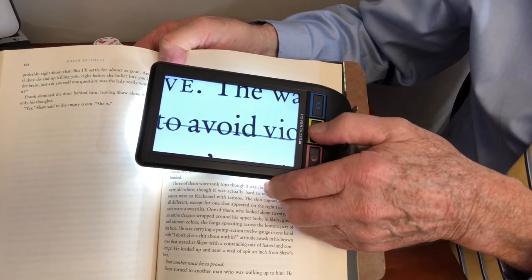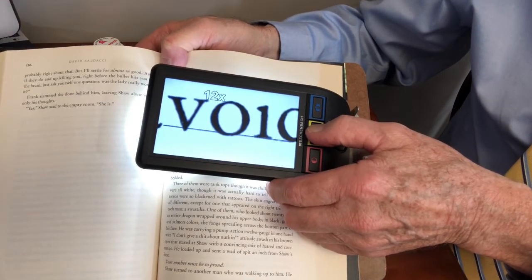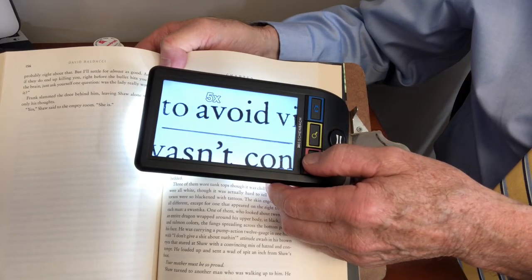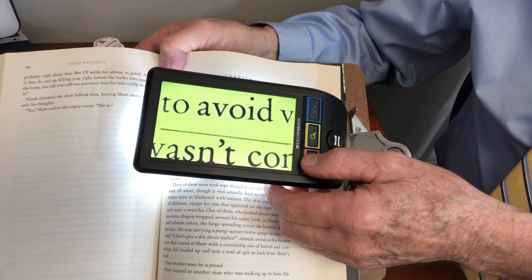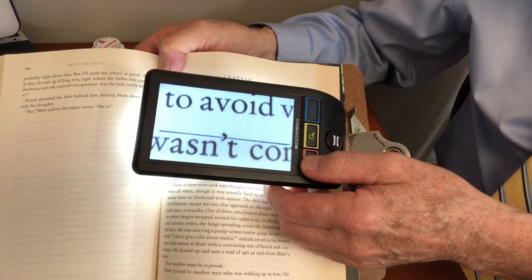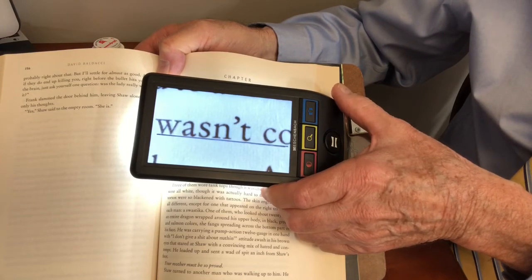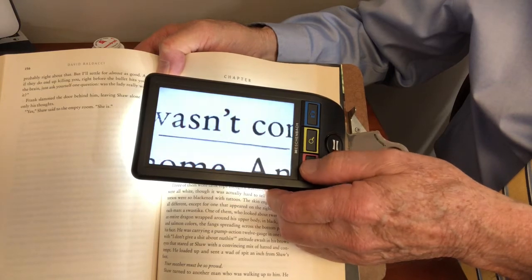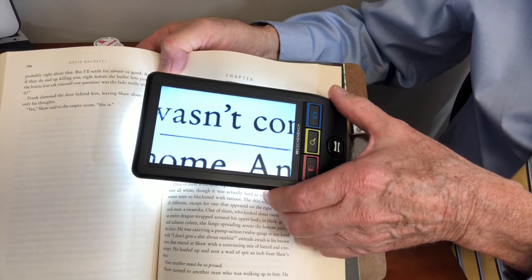You can change the magnification of it — there are four different magnification levels and there are also different color arrangements: high contrast black and white, white on black, black on yellow, yellow on black, and the final one is full color. Full color is nice for looking at photographs but not very good for reading a book. Click it one more time and we're back to high contrast. You can see that makes a big difference. So the Smart Lux Digital is a very nice device.